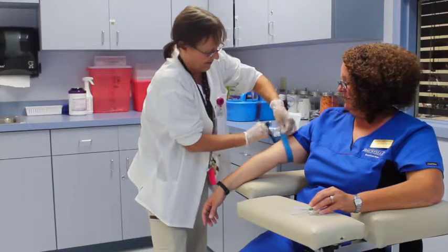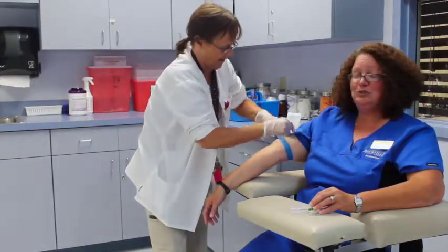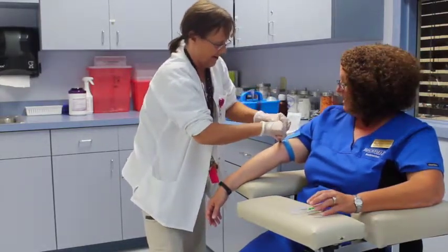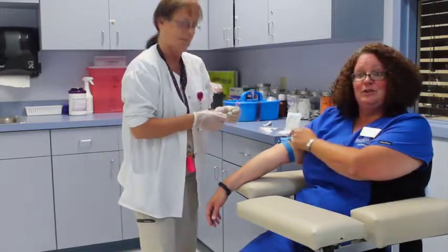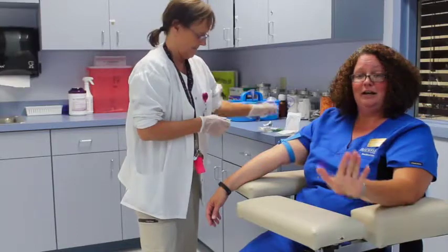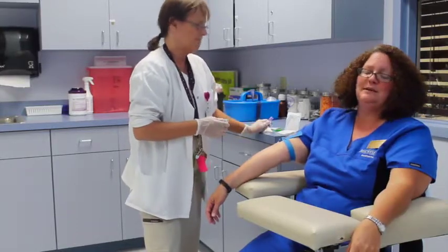When you apply the tourniquet, you want to make sure that it is nice and tight but not too tight to cut off circulation. You also want to make sure that this little flap here is sticking up so that you can immediately release the tourniquet. It can only stay on an arm for approximately one minute.